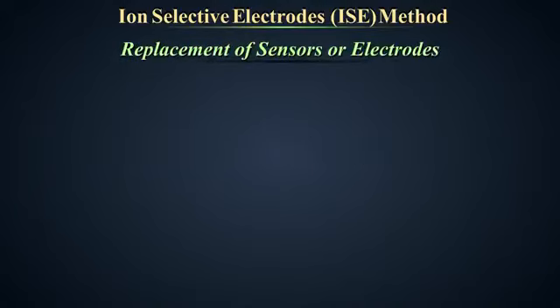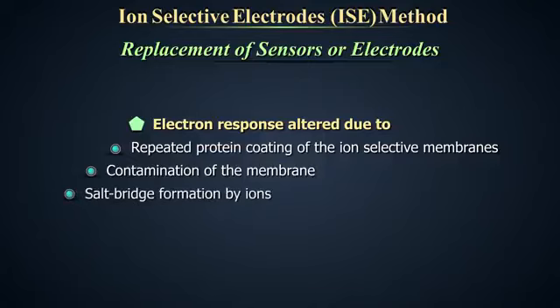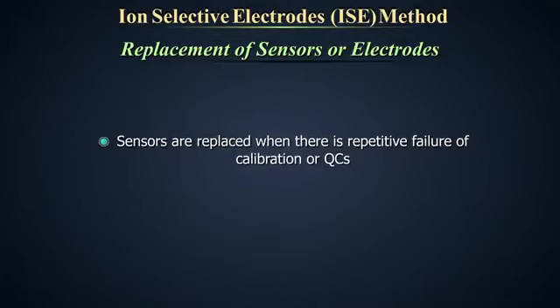Replacement of sensors or electrodes. Repeated protein coating of the ion selective membranes, contamination of the membrane, and salt bridge formation by ions can all alter electrode response. These necessitate periodic changes of the membrane as part of the routine maintenance. The sensors should be considered for replacement if there is a repetitive failure of calibrations or quality controls.